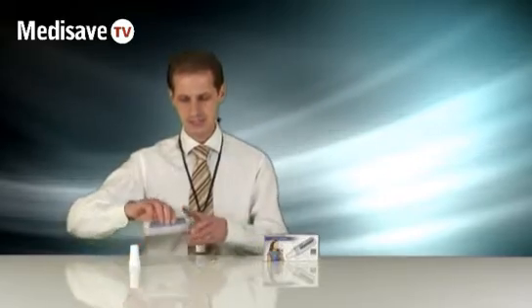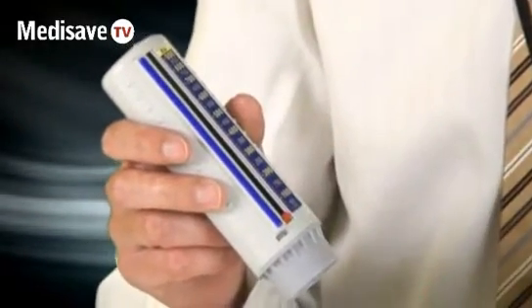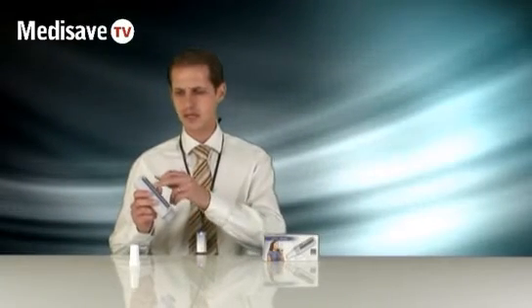The Peak Flow Meter has some unique points on it. It comes with a blue strip, but it also has some coloured strips that you can set to the individual zoning, so the patient doesn't have to remember they're at 700 — they can just remember they're within the green zone.